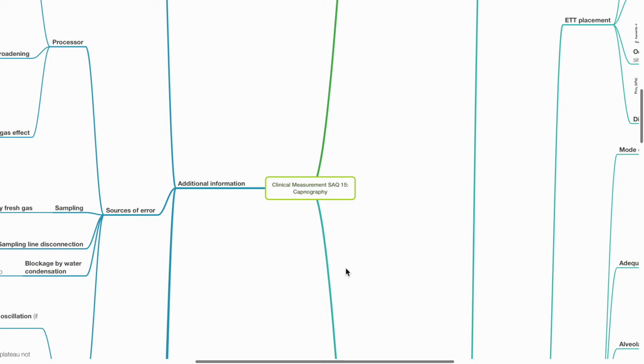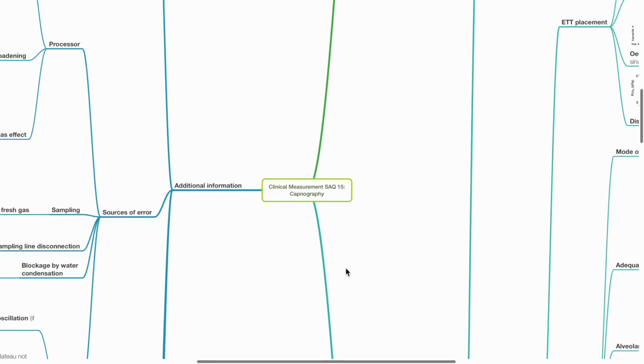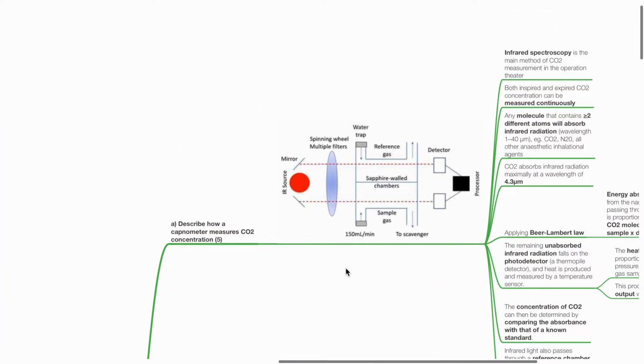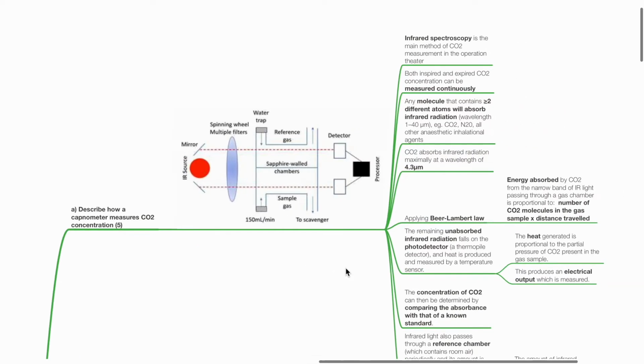Clinical Measurement SAQ 15, Capnography. Describe how a capnometer measures CO2 concentration, 5 marks.